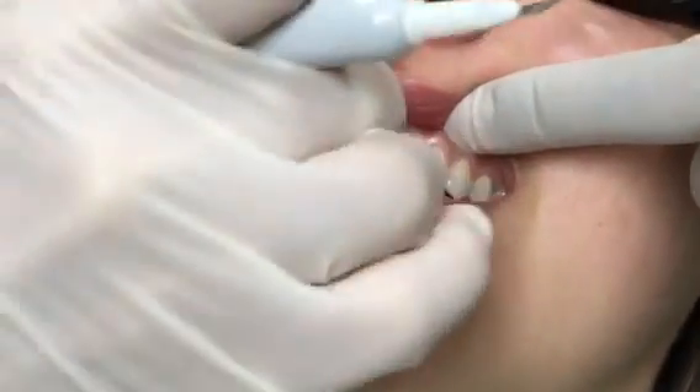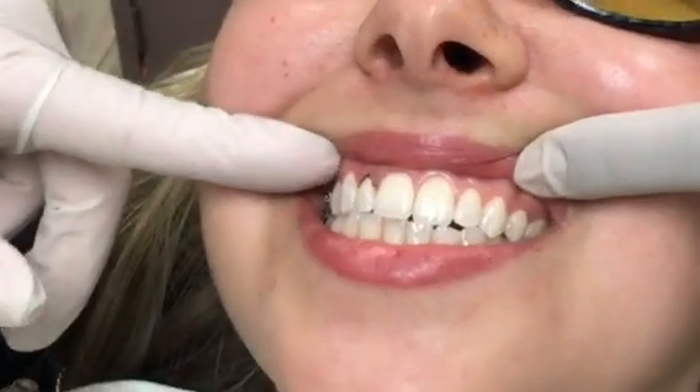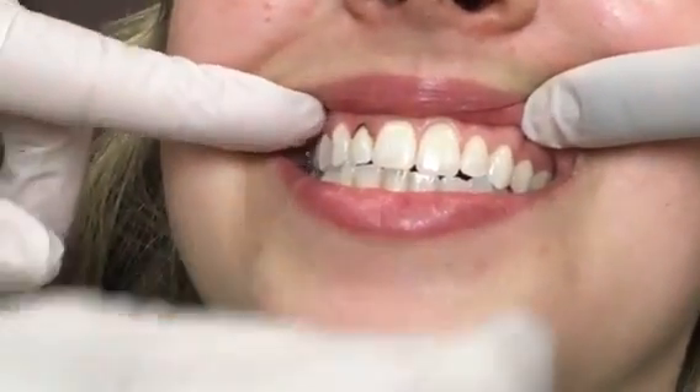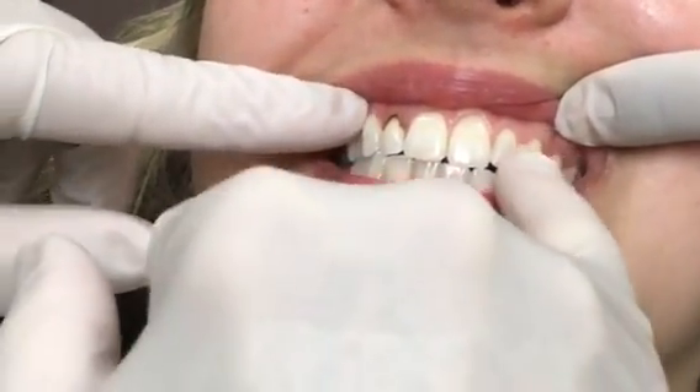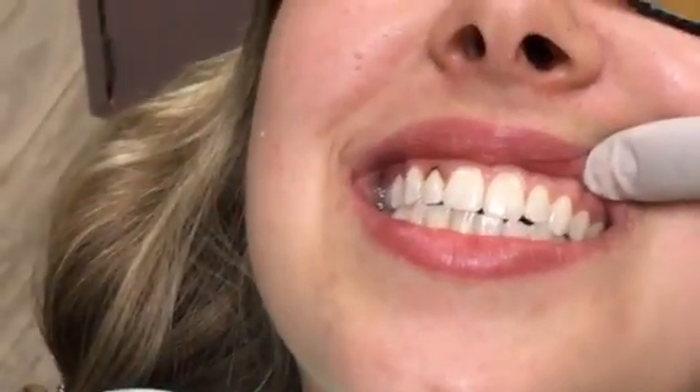Now you can see what we've done here — we're going to just clean that off. And you can see how much better that is. We might have to do a little bit more, but you can see how we're starting to create it where it's a little bit more even. So this gives you a little bit of an idea of how you can actually create more symmetry and the teeth can appear more even just by doing this simple procedure. It's quick, it's easy, it's painless, and it's not expensive.